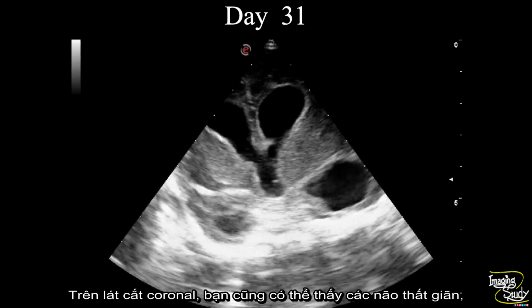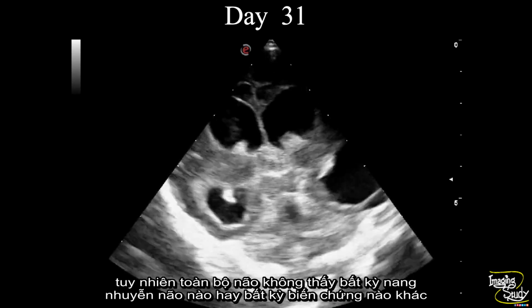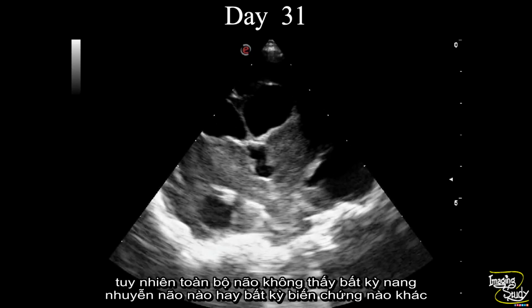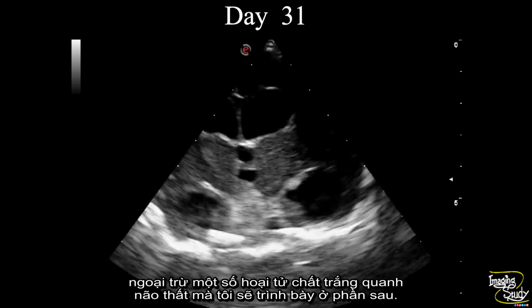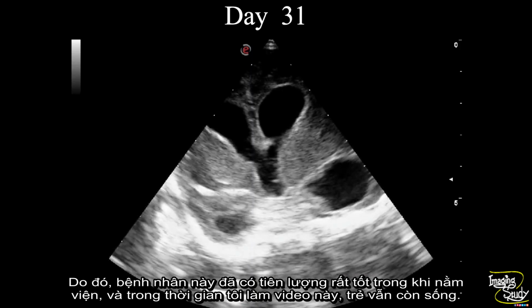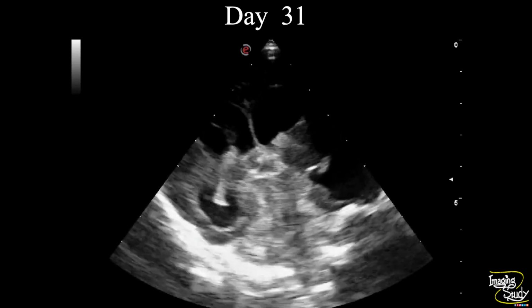On coronal section, you also can see these dilated ventricles. But overall, the brain parenchyma doesn't contain any porencephalic cyst or any other complication other than some periventricular leukomalacia, which I will cover slightly later. So this baby had a very good in-hospital prognosis, and while I'm making this video, the baby is still alive.